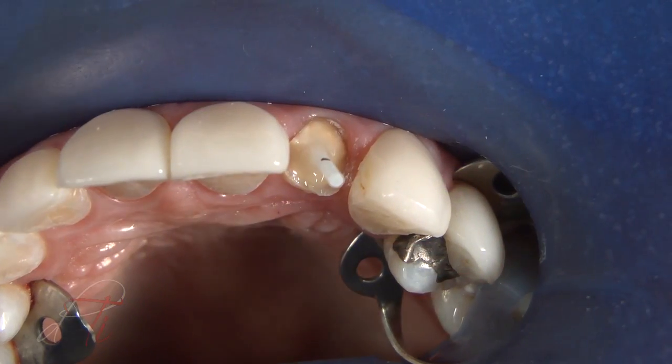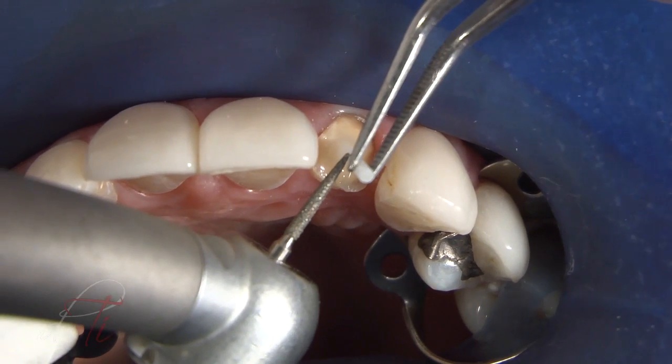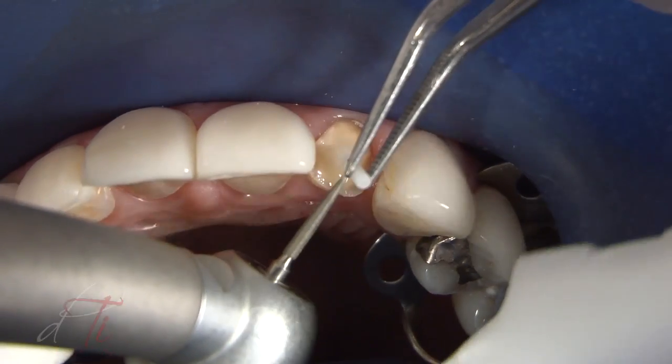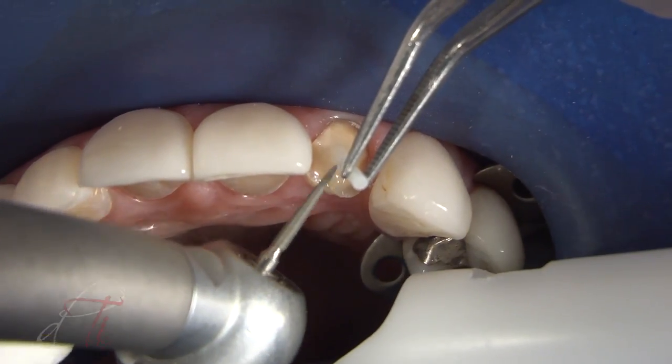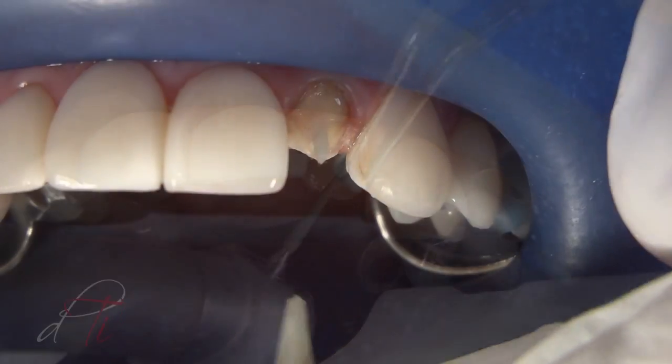After polymerization, the fiber post was cut with a diamond burr — an 888 by Brassler — to the predetermined length. Never use a serrated instrument or shears, as this can damage the integrity of the post.